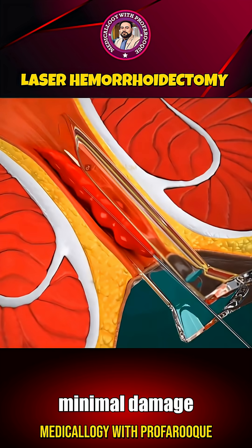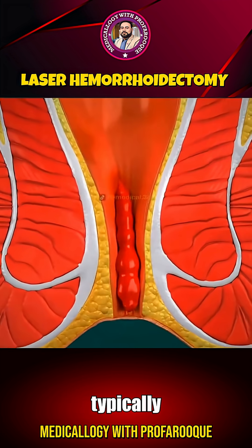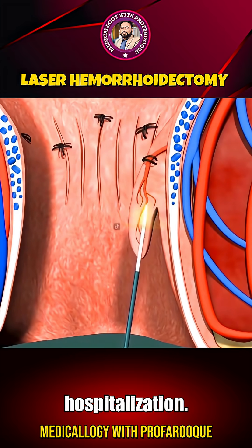There is minimal damage to the surrounding tissues, leading to far less postoperative discomfort and inflammation. The entire surgery typically takes just 20 to 30 minutes, and most patients are discharged on the same day without the need for extended hospitalization.